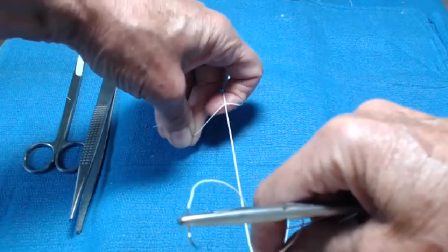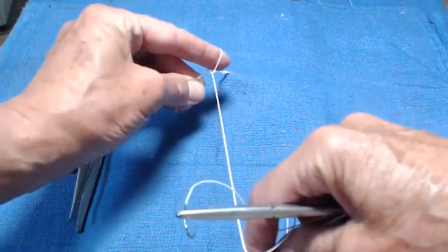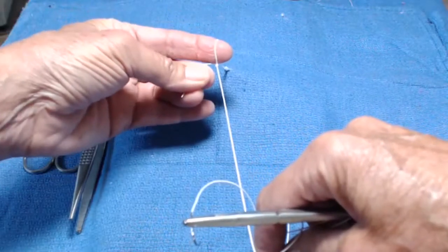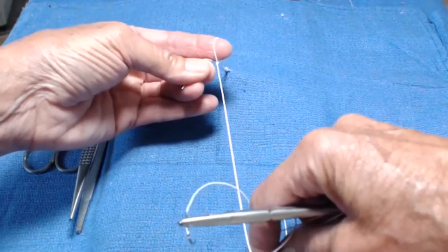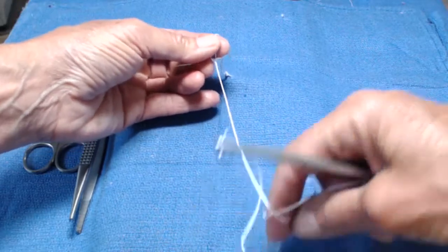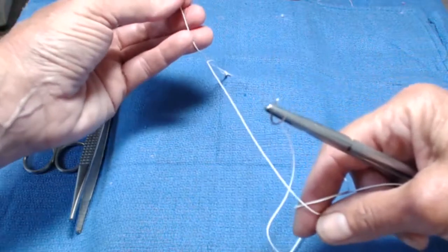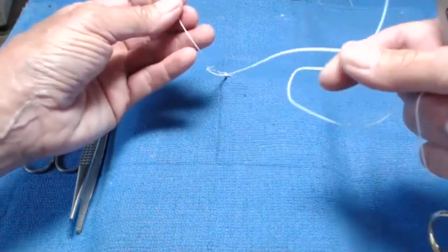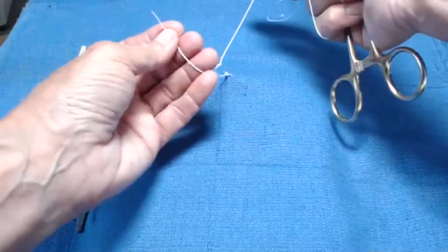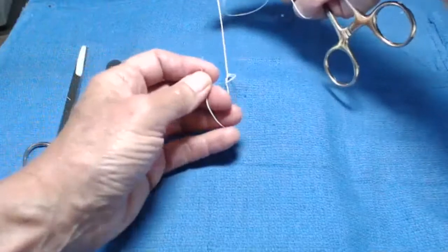Acutely bend that pointer finger, catch the short end, bring it up like a balloon through the V of the reverse four, bring my thumb closer — and this is the part where people get confused. I want to just go up gently and put my fingers against it, keeping no tension, very light, and then reverse my hands, and there we see the half knot forming.